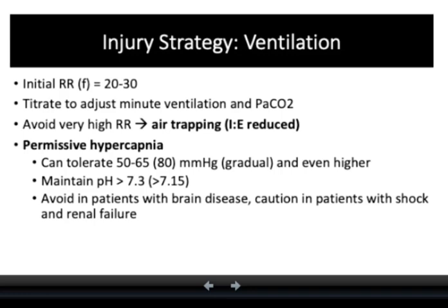Whenever you have a patient with lung parenchymal disease, your number one goal is not to normalize blood gases, but to prevent further lung injury and give the lungs time to heal. To avoid ventilator-induced lung injury, you will need to sacrifice something, which is usually your CO2 level. In other words, hypercapnia is a trade-off for lung protective ventilation.